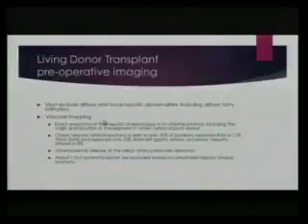It's really important to do vascular mapping. They need to know the exact anatomy of the hepatic arterial supply. Is there a replaced right hepatic artery? Is there a replaced left hepatic artery?